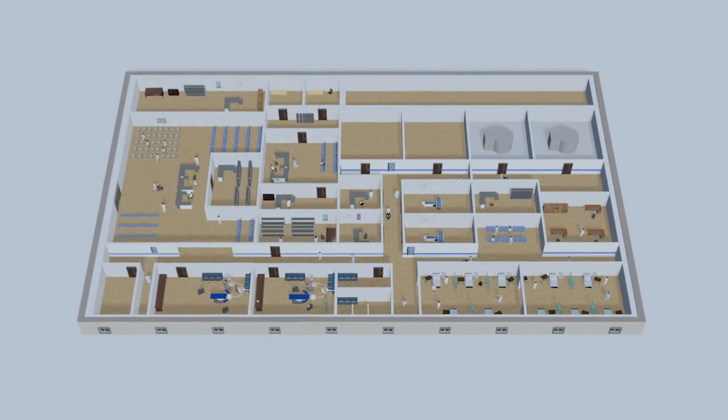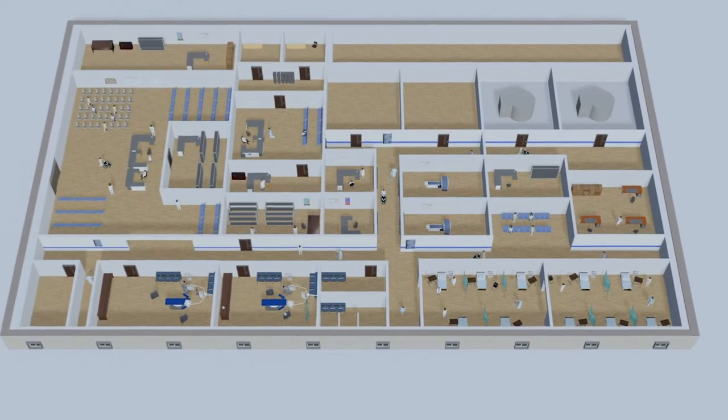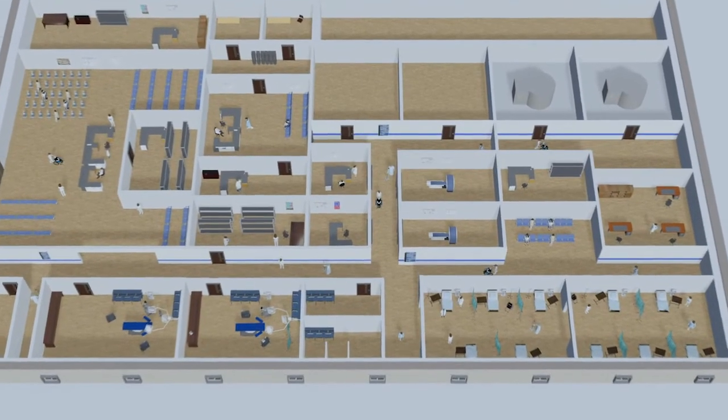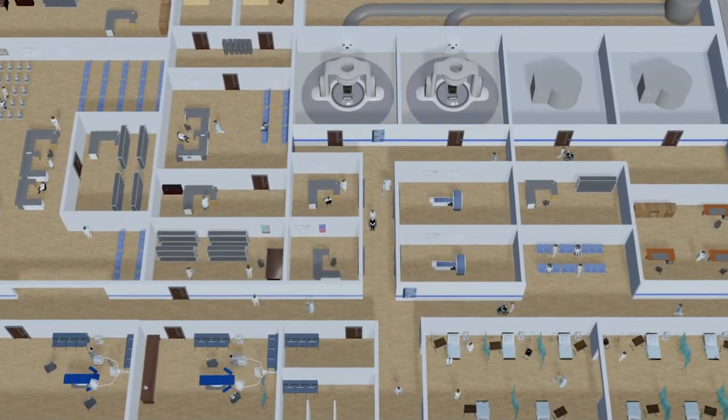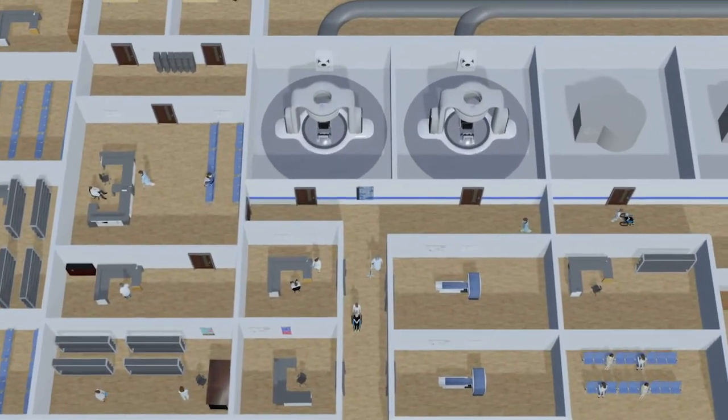Gone are the days of stand-alone centers. We bring particle therapy into existing departments, making these life-saving treatments more affordable for the patients that need them most.